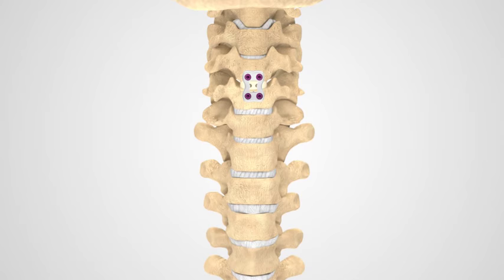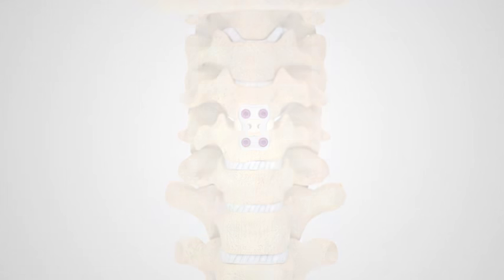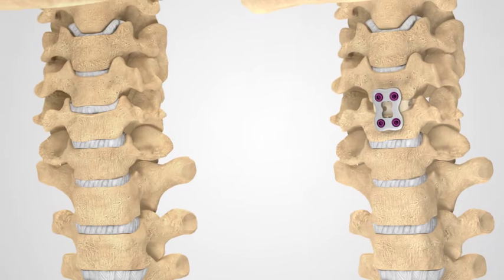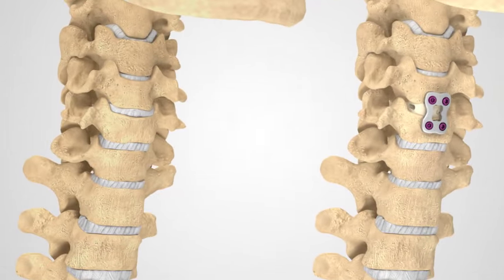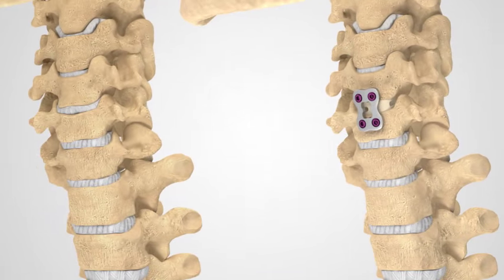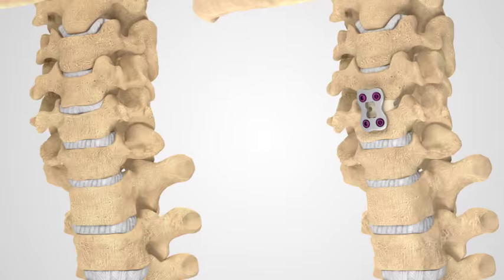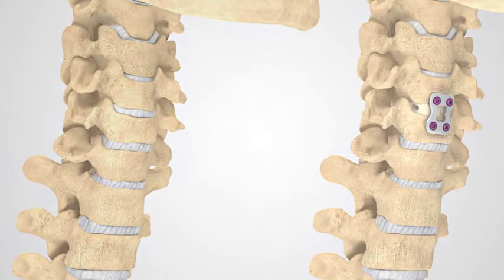Meanwhile, the fixation devices will act as an internal brace and help hold everything together. This model shows the application of an anterior cervical discectomy fusion. Once fusion occurs, that segment of your cervical spine will stabilize. While ACDF usually relieves pain and other symptoms, it does result in loss of motion at the fused levels.